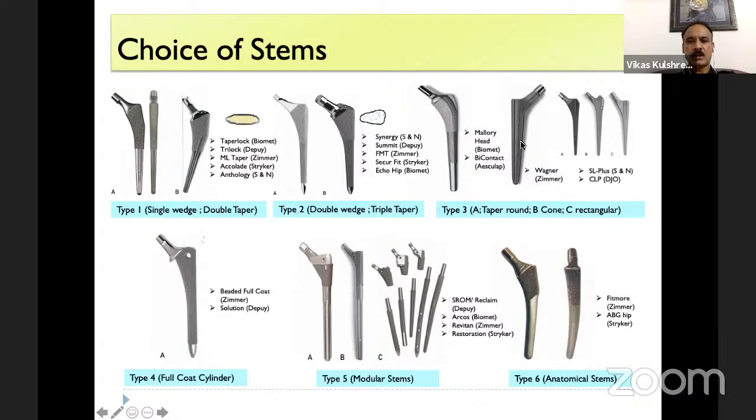They are conical and they wedge into the proximal metaphysis, going slightly into the diaphysis, much smaller than the standard Wagner stem. And then there is the Zweimüller type of rectangular stems. If you cut them into a section, they are rectangular. They again fill the canal and they are a metaphyseal-diaphyseal fit. They really did not pick up in our country and are mostly seen in European practice.